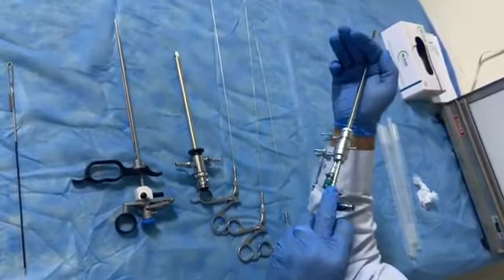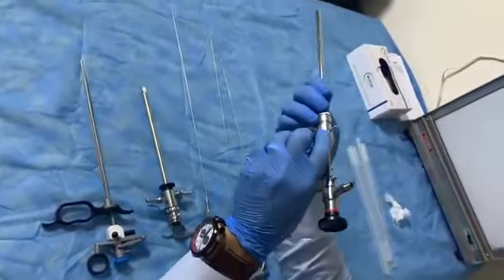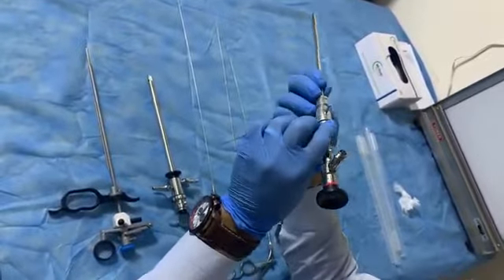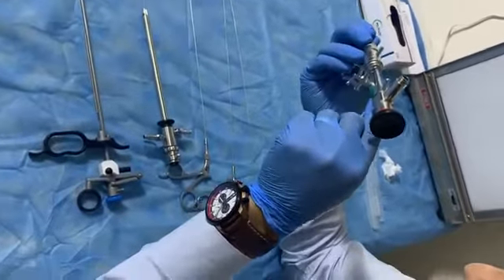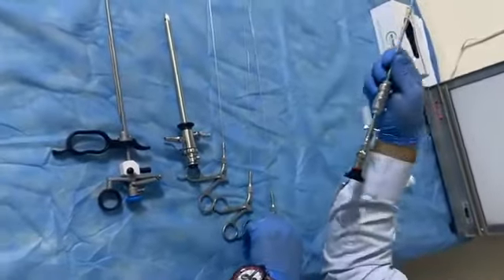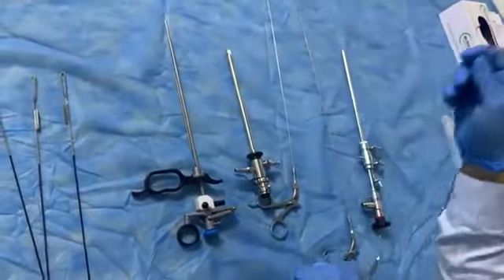thighs of the patient. This type of hysteroscope is also therapeutic, because there is another channel here. Through this channel we use another instrument like scissors or a grasper.